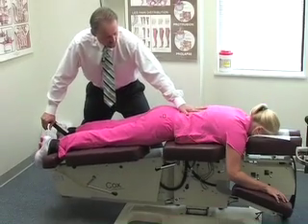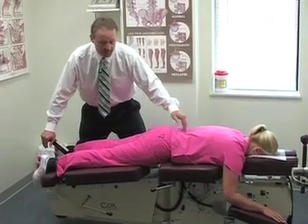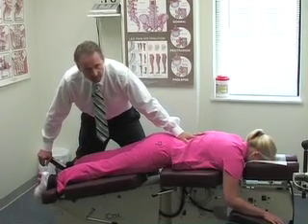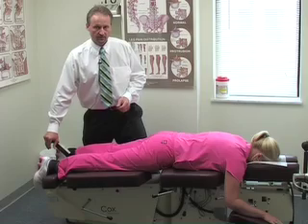Also conditions like spondylolisthesis. For example, we can focus in on a level, for example, in L5 spondylolisthesis, we'll contact the segment above. So for an L5 spondylo, we'd contact L4 and distract caudally. So it's very focused. The physician can direct the treatment right at the exact level where the problem is.